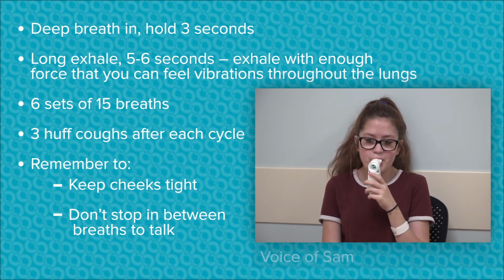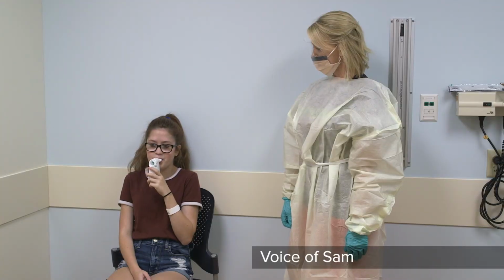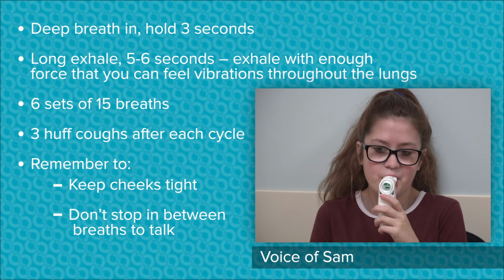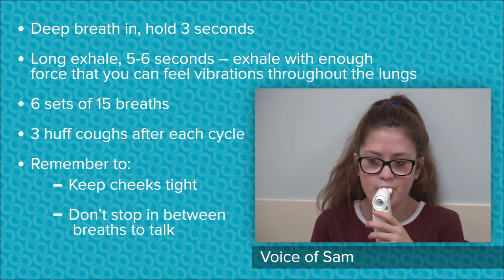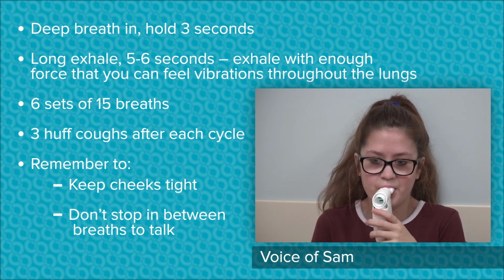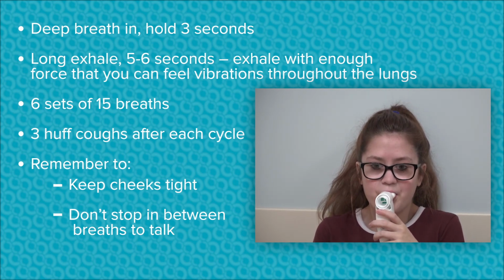Good job. So I like to use the Aerobika when I'm on the go. If I need to get somewhere and I have a certain amount of time to get there, I feel like that helps a lot. I don't want to do it on days where I don't feel as well because you have to really make sure you're taking good deep breaths and blowing out nice. So when I'm sick, you know, I might not want to lean towards that.